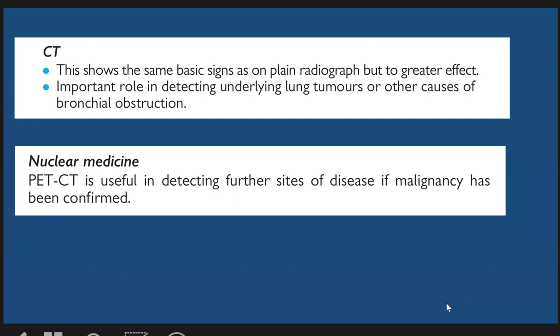On CT scan we see the direct and indirect signs. CT plays an important role in detecting underlying lung tumors or other causes of bronchial obstruction and infection. In nuclear medicine, especially the PET-CT scan, it is useful in detecting further sites of disease if malignancy has been confirmed.